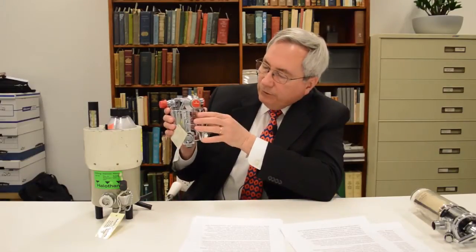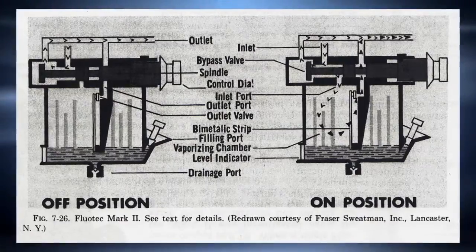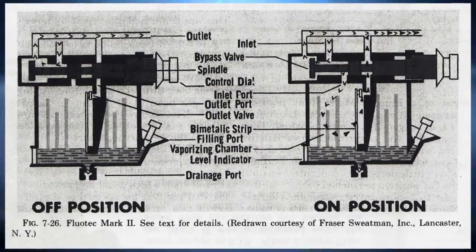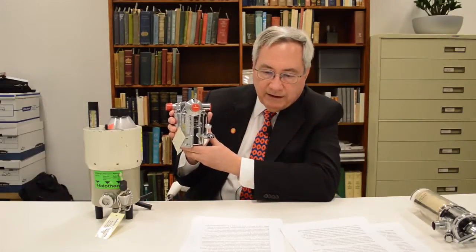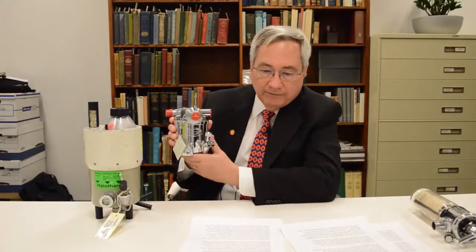If you would look within this vaporizer, you would see a bimetallic strip that adjusts the gas bypass to compensate for changes in temperature. It was used outside of the patient circuit so that only fresh gas flowed through it. And this was an advantage because since you knew what was coming in, i.e. none, then that reduced the variability in what was coming out of it.